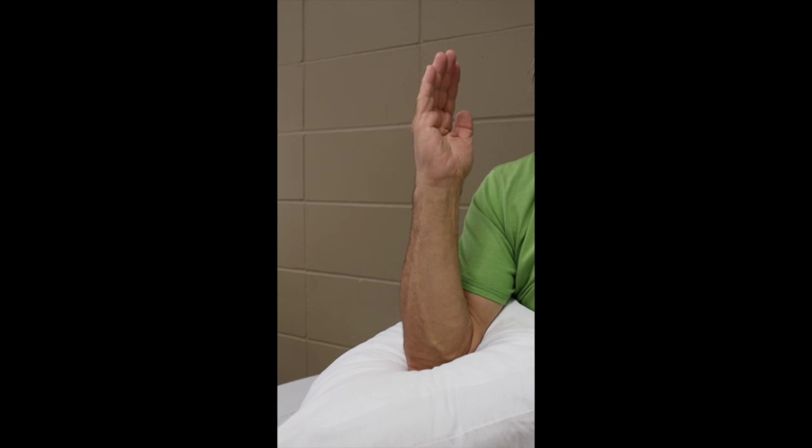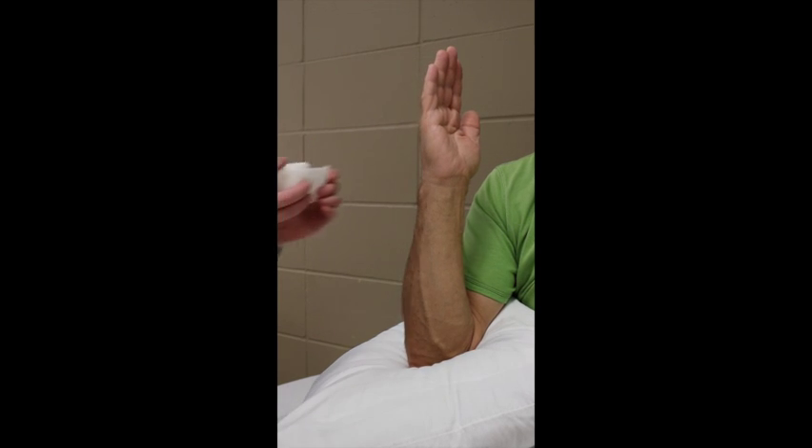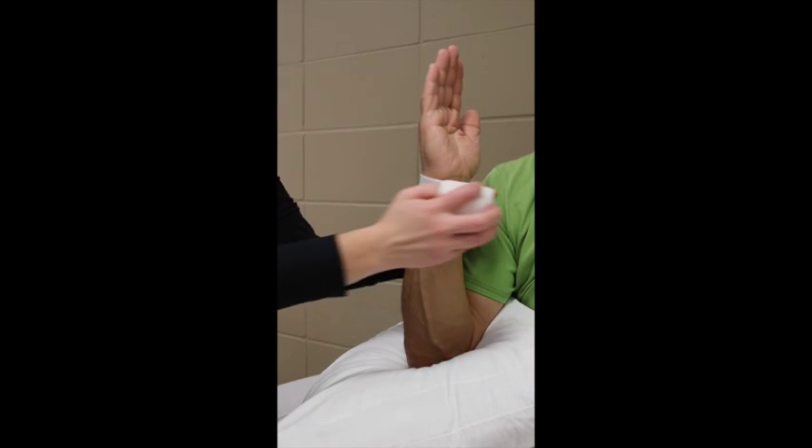To begin, position the patient in a comfortable seated position. This could be at a desk with the arm resting on the tabletop, or on top of a gurney or exam table with pillows under the arm for support. Advise the patient to point fingers toward the ceiling and thumb towards the shoulder to keep the forearm in neutral position.